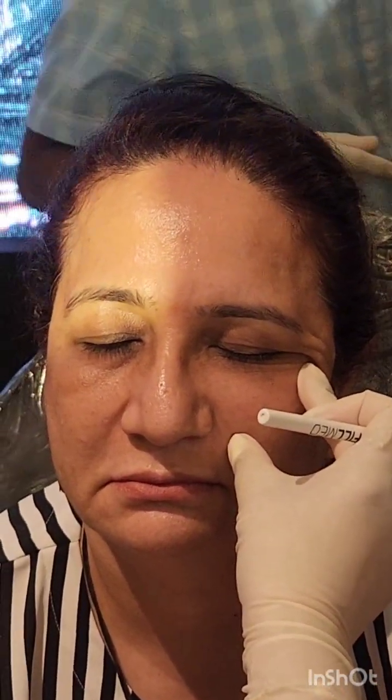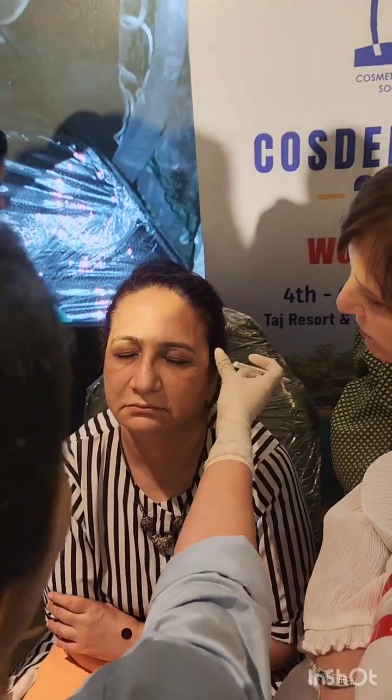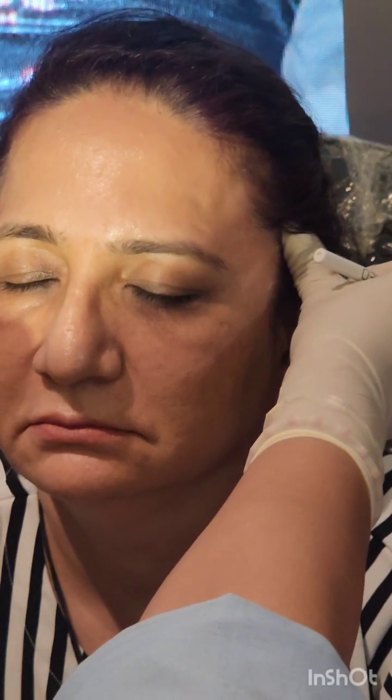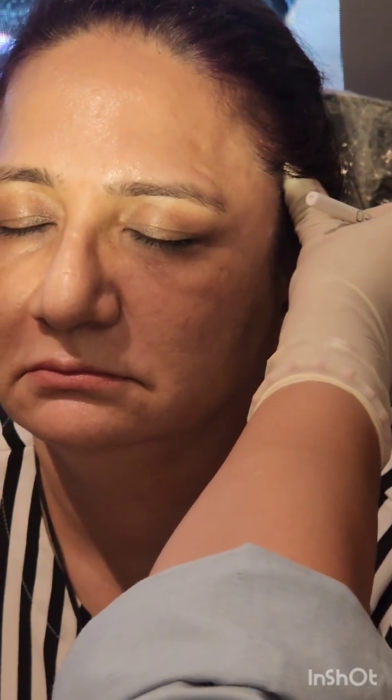So is it going to give any kind of lifting in later period of time? No. And it will become a floating type because there is no anchoring here. If I'm lifting her from here, are you getting any lift? Yes. No, you are not. Not much. Why? And here you'll be introducing most of the needle.